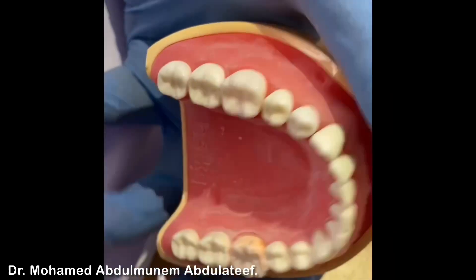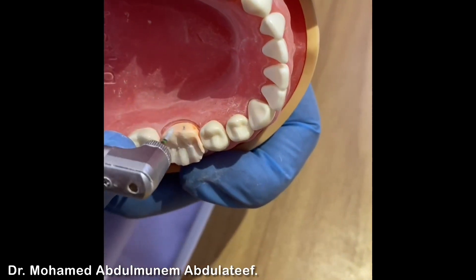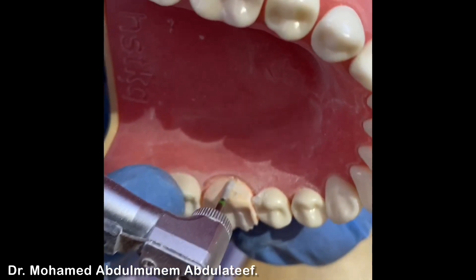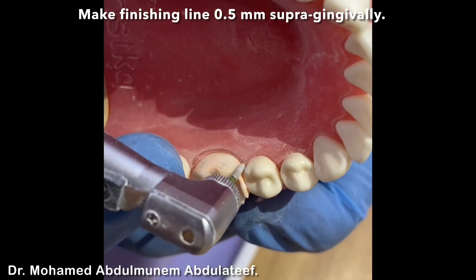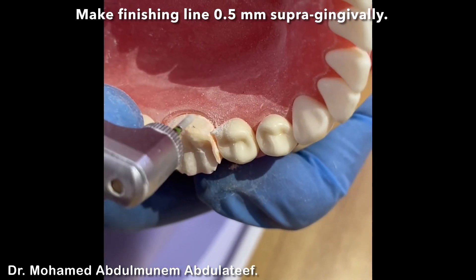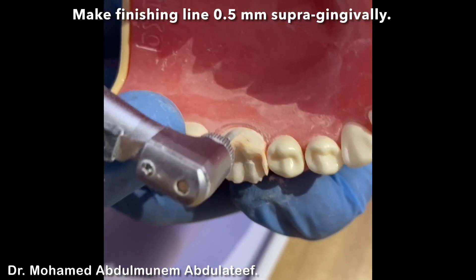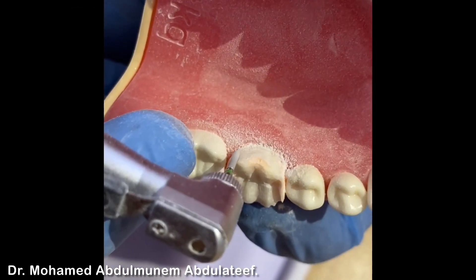Now we'll do the lingual reduction, same manner but with one plane instead of two plane reduction. We can mix between the orientation grooves and follow the drawn finishing line with the pencil. Remember not to hit the adjacent tooth. Do not incline your bur. By doing a single smooth move, move the handpiece and bur carefully until the finishing line is well prepared.